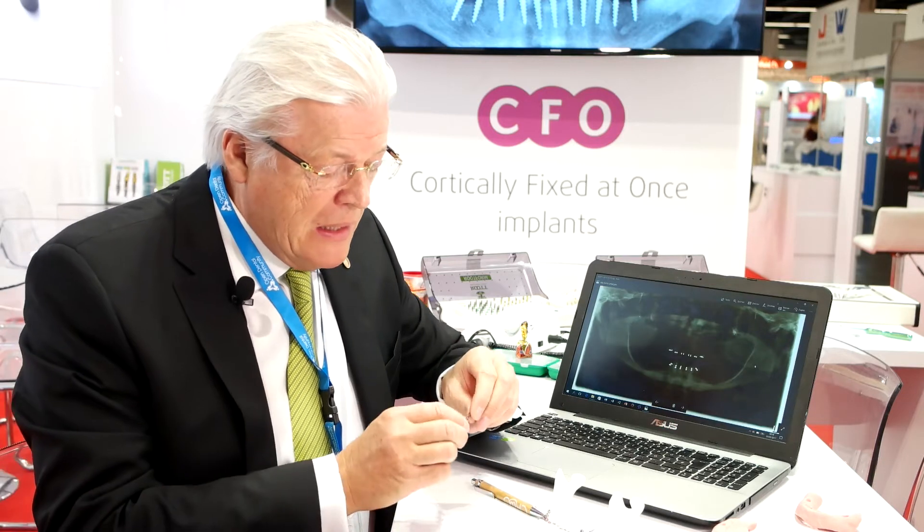The cortically-fixed technique involves placing one-piece or two-piece implants in the front where we have bone, and then here in this region, to avoid the cantilever, we are putting plates — special hybrid plates — which are highly flexible so they can be adapted to all situations.